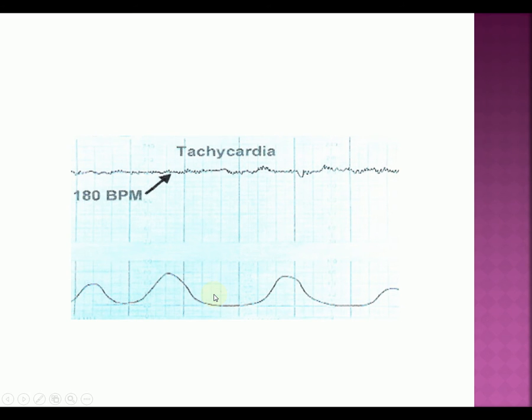So this isn't a very good picture of a fetal monitor strip. The ones that you have on your test are much better than this one. This is just where I wanted to show you basically about the contractions. Each one of these big blocks is a minute. Within the minute, there are 6 columns that each count 10 seconds.